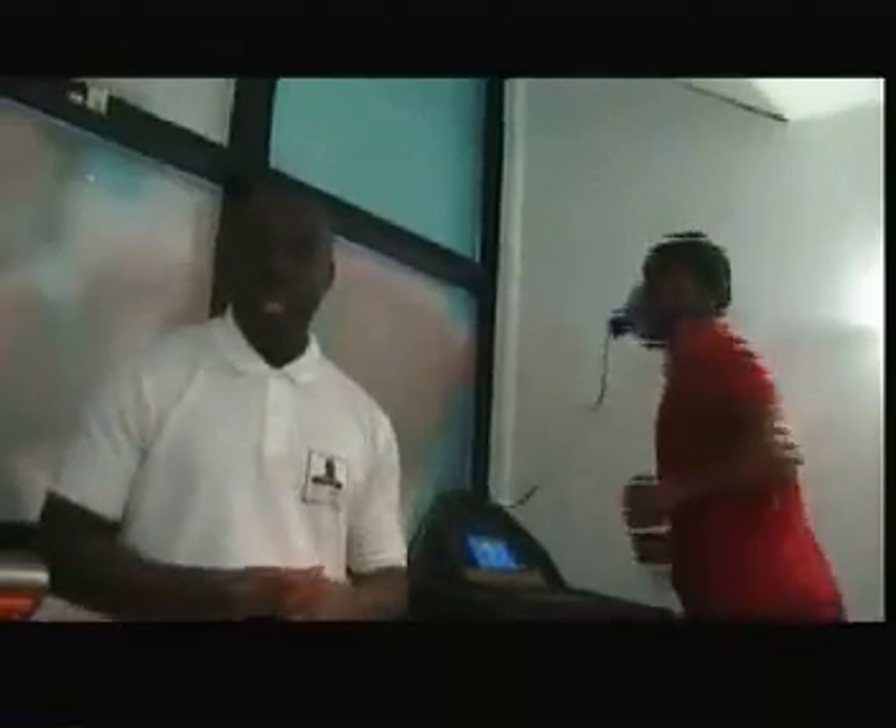Hi, my name is John Mollipal. I'm the Director of Equity and Training Systems, and what we're going to do today is take a little bit of a look at how we measure someone's VO2 for their aerobic fitness.